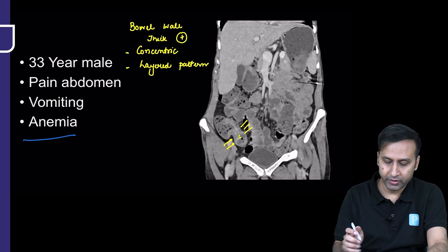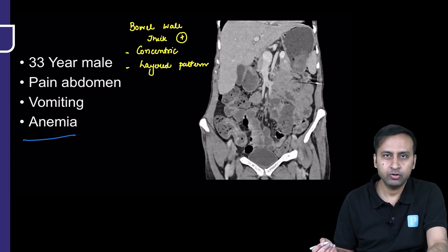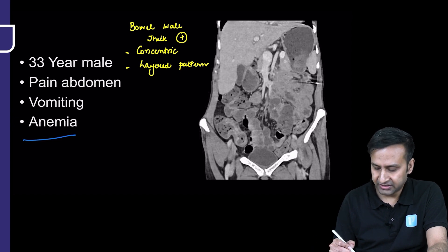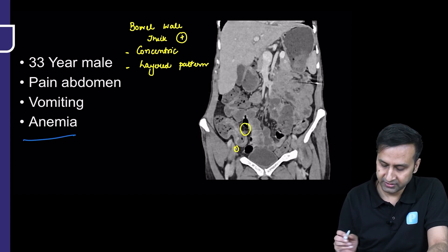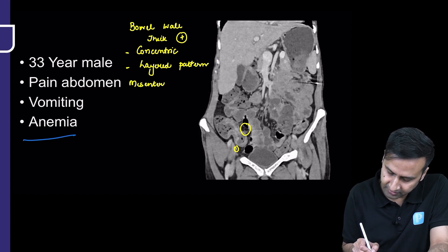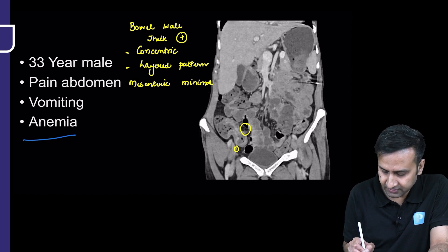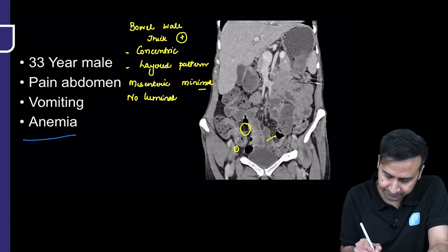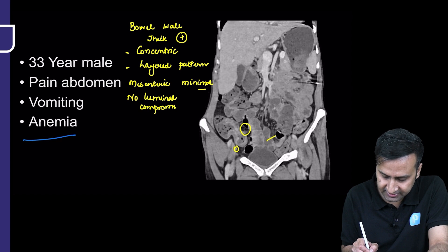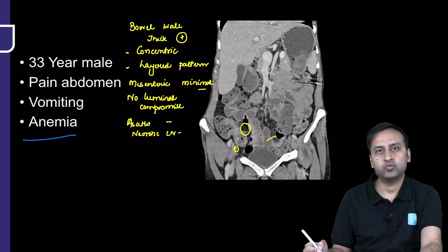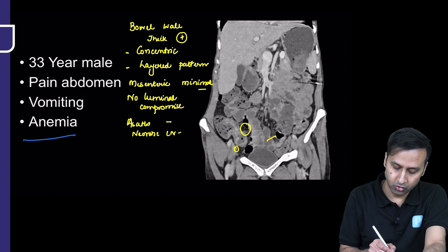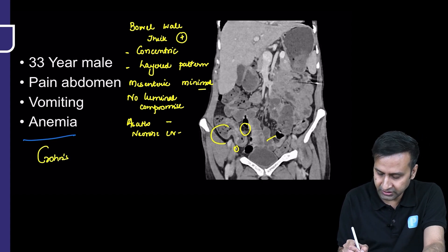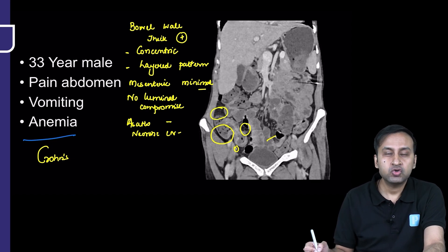Looking adjacent to the thickened bowel: no significant lymphadenopathy. Mesenteric fat stranding is very minimal — some can be seen here and there but largely absent. No luminal compromise, no bowel obstruction, no ascites, and no necrotic lymph nodes. Our diagnosis was Crohn's disease, supported by a normal cecum and normal ascending colon.